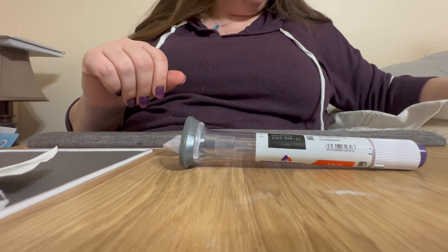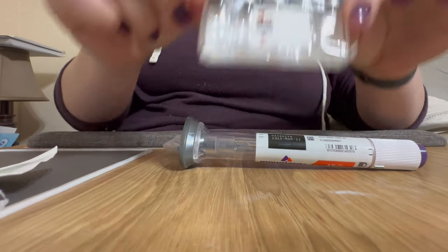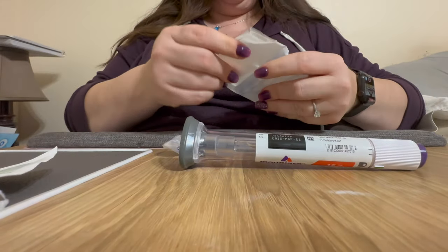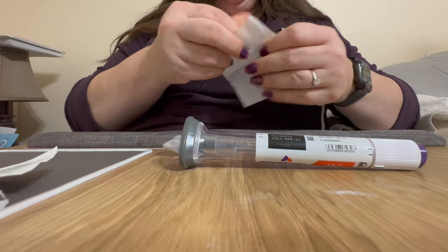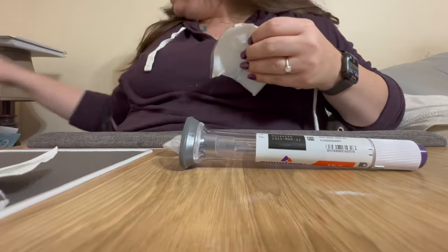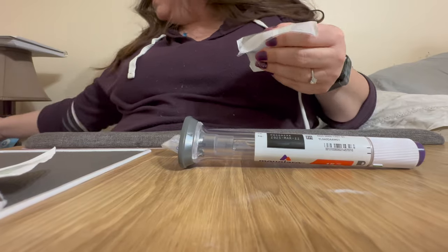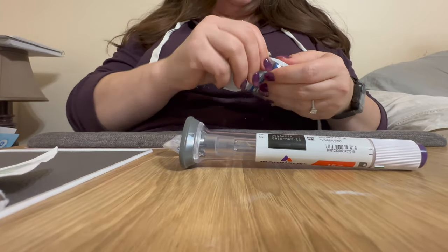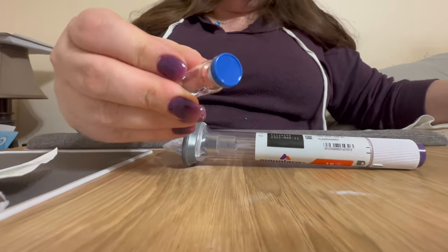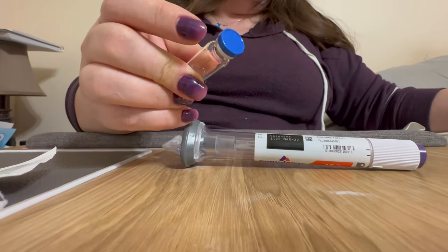Another thing you need is sterile vials. I use the 3 milliliter size — you can get a smaller size if you want, but that's a good size. These are available on Amazon or through various medical supply stores. Just make sure you're getting sterile vials. They'll have a little cap on them — don't take that off until right before you are ready to do this.